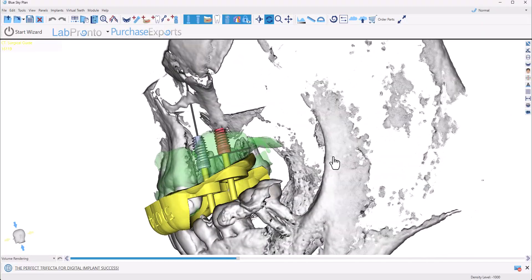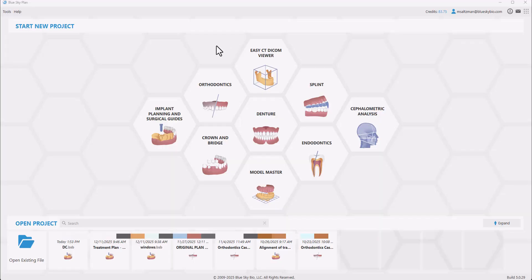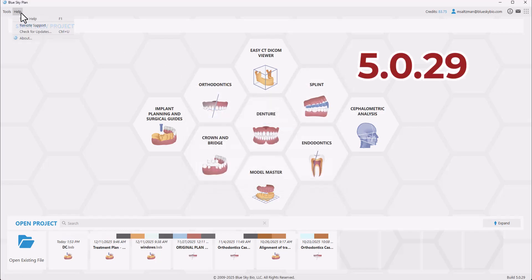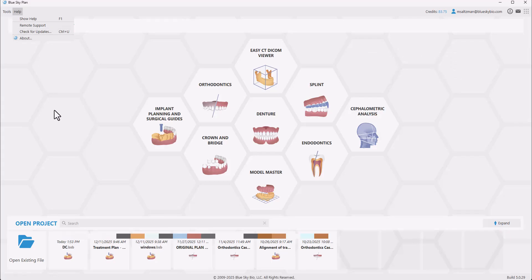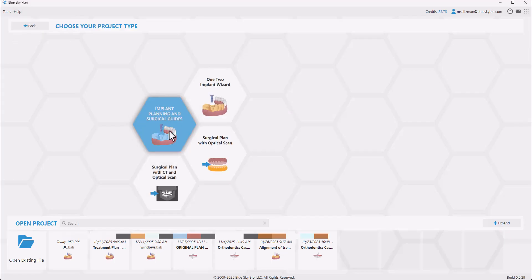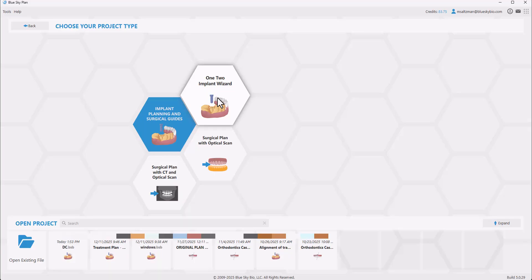Let's get started. We'll be using the latest version of the Blue Sky Plan software, version 5.0.29. If you're using an older version, simply go to Help, Check for Updates to update to the latest version. We're going to start the process by clicking Implant Planning and Surgical Guides, and we're going to select the option for 1-2 Implant Wizard.